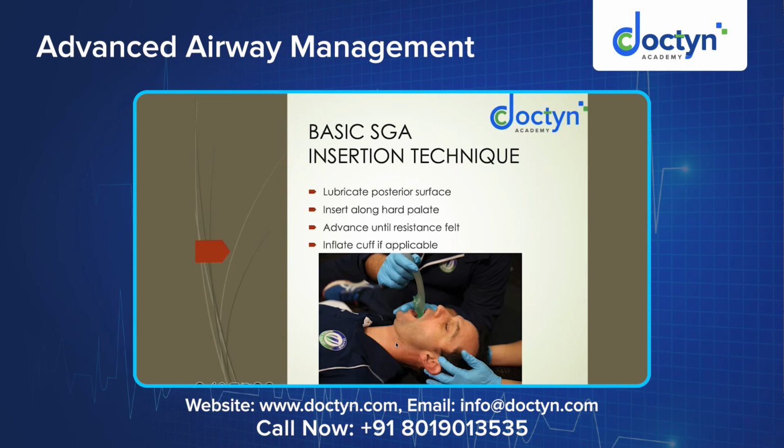This doesn't need any expertise or video laryngoscopy. It can be put even in the ambulance. Paramedical staff are also trained for this laryngeal mask airway insertion. And inflate the cuff if applicable. If it is a laryngeal mask airway or supraglottic airway device where cuff inflation is required, you inflate it. Or else, in this particular LMA, the iGel, there is silicone gel with self-inflating, self-sealing technology that doesn't require further inflation. If you pick the right sized supraglottic airway device, it will seal automatically.